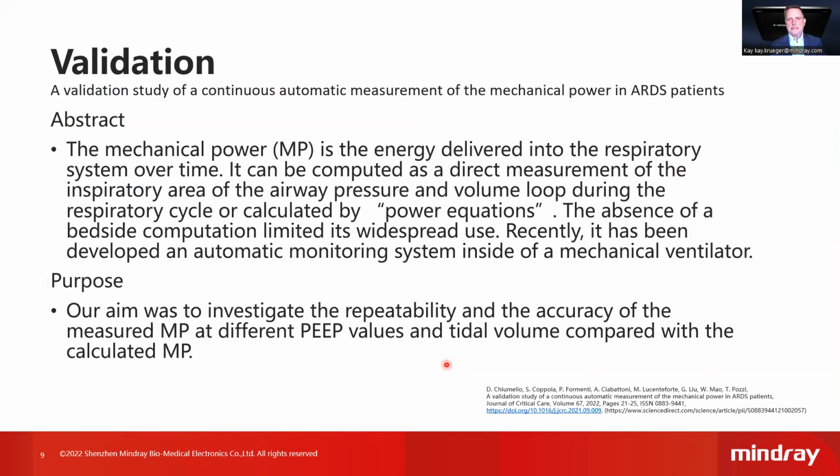Mechanical power as a measurement has been implemented into a mechanical ventilator, which then provides a constant, permanent display of the mechanical power actually applied during mechanical ventilation. And a study has been done to validate whether that is accurate. Here you see in the abstract the mechanical power is the energy delivered into the respiratory system over time, which we have already discussed.